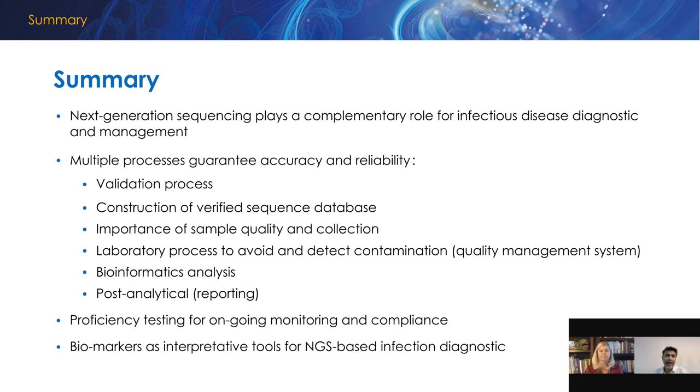That's something that the microbiology lab also observed with the introduction of the MALDI-TOF. We were used to only basing our identification on biochemical reagents, and now when we have the MALDI-TOF, we start seeing new organisms showing up, organisms that we never heard of before. So the same situation will happen with NGS. We should be open-minded, but at the same time, critical and rational, trying to explore different opportunities and see the significance of those organisms, and be able to collect data and provide that data to future developed clinical guidelines to be able to implement NGS in laboratory settings.